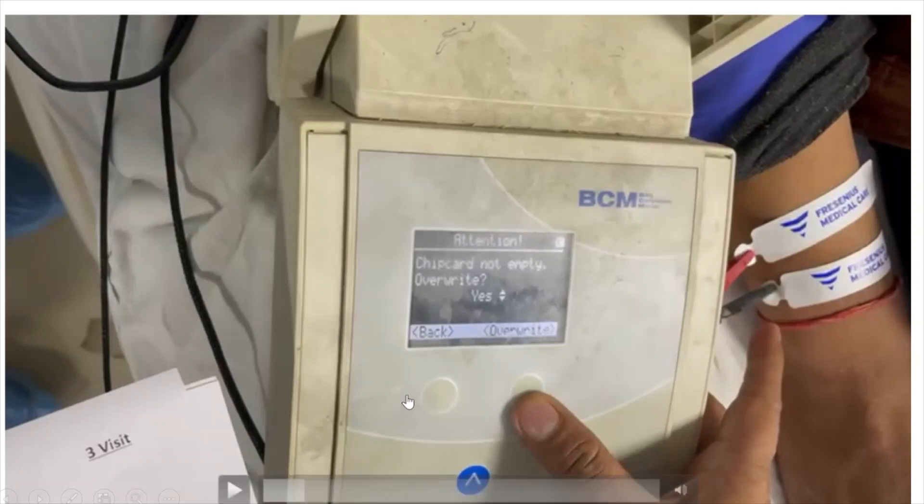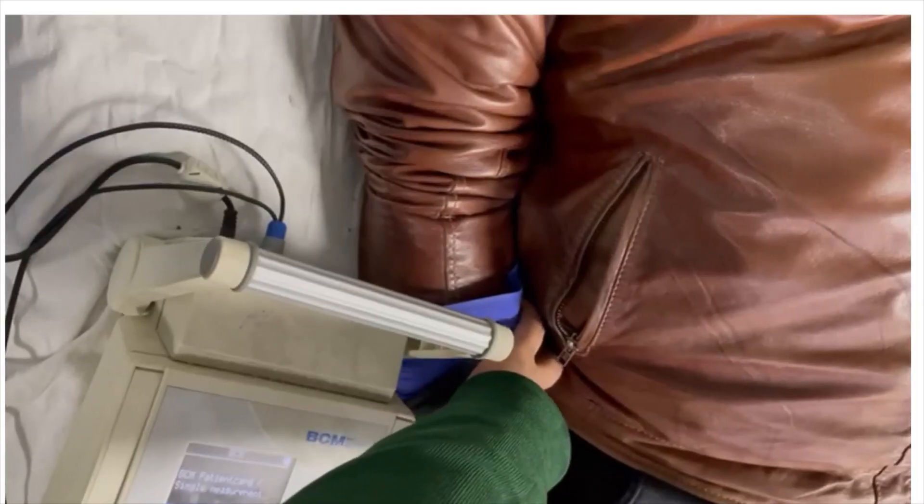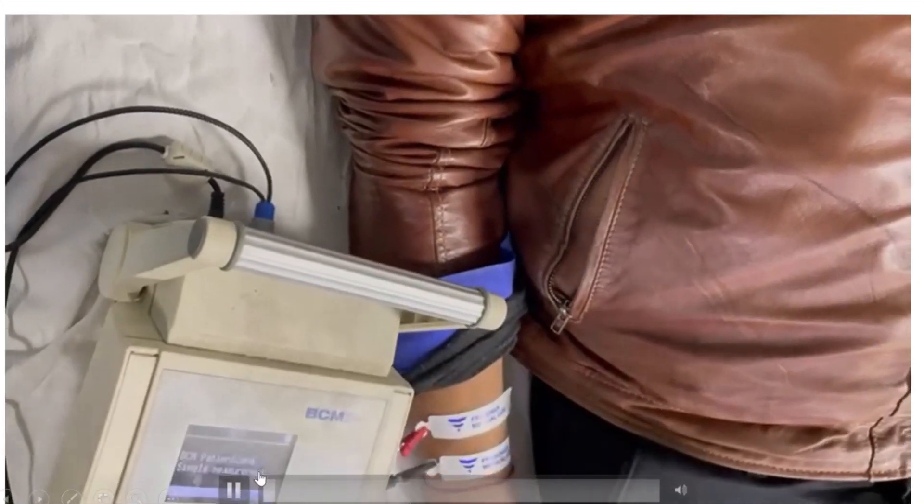As soon as we begin, the monitors will start displaying. If a previous patient's data exists on the chip, we have to overwrite it. Whenever you insert a new chip it always shows that prompt — just select yes to overwrite the data. After that, we start entering the patient's basic details.